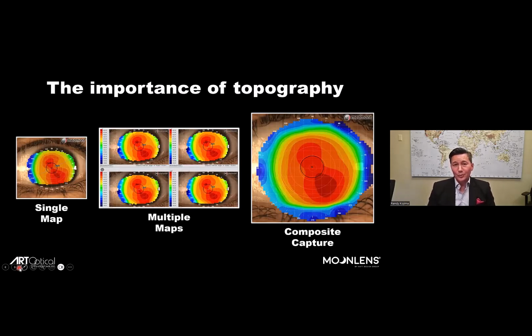Now, topography we're really, really critical of, and Bethany and her team in the consultation department will tell you how important baseline topography is. It either gets us off in the right direction and we have a good chance of high first fit success, or it gets us off in the wrong direction and our initial lens doesn't fit the way we want it to or perform exactly as we desire it to. So topography becomes super important.